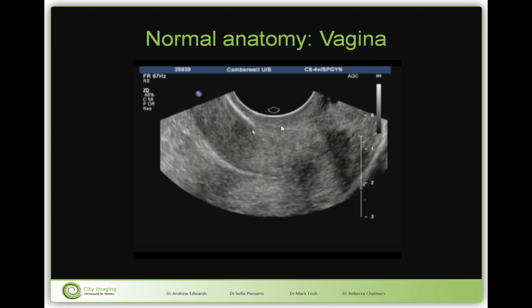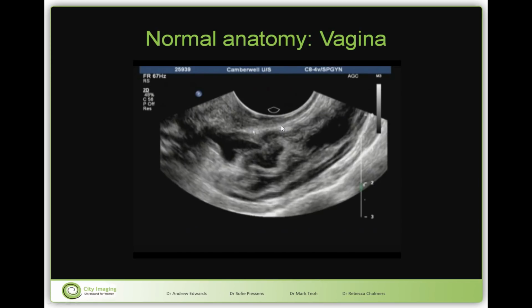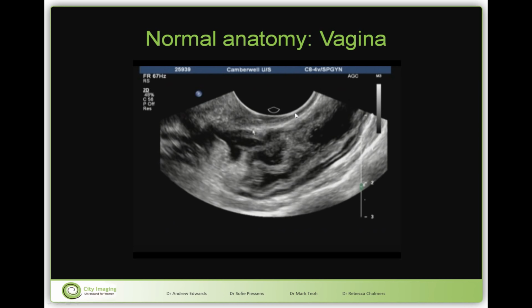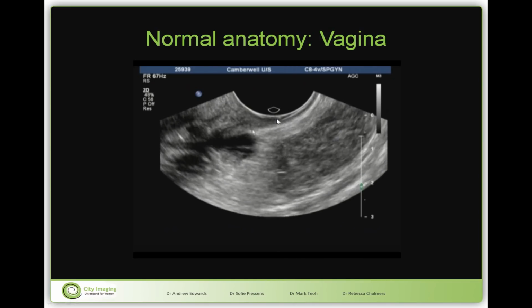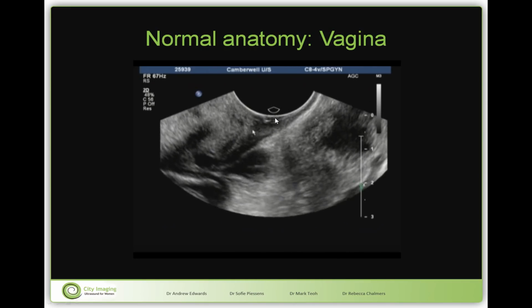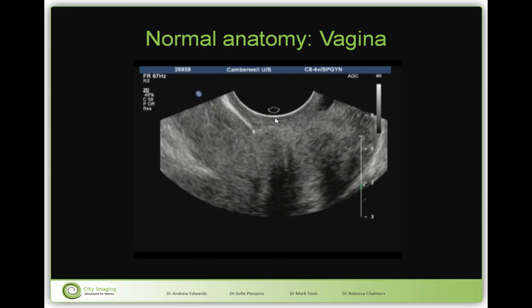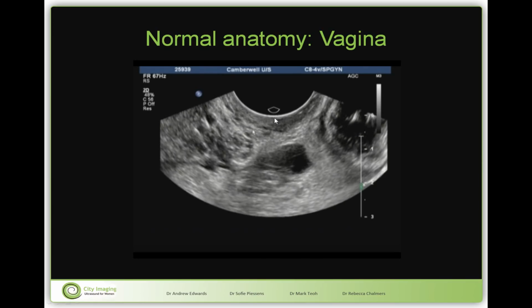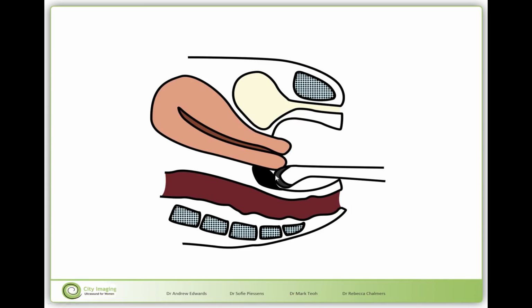And there we're back anterior to the cervix. But the vaginal wall is always regular, everywhere approximately the same thickness, and you move from left to right in the posterior fornix, just looking at the vaginal wall everywhere. When there is a vaginal nodule, it will be very obvious. They stand out. But if you don't put the probe in the posterior fornix, you will completely miss the vaginal nodule. It is invisible.